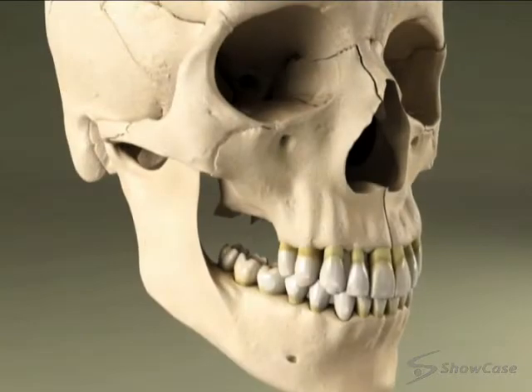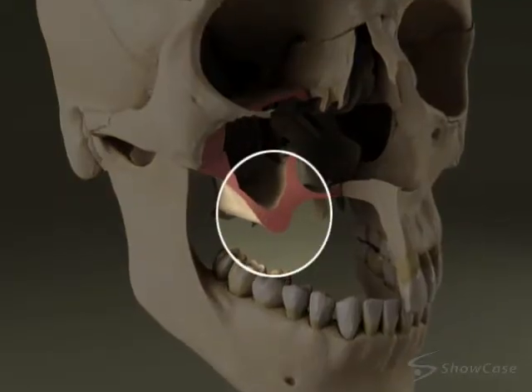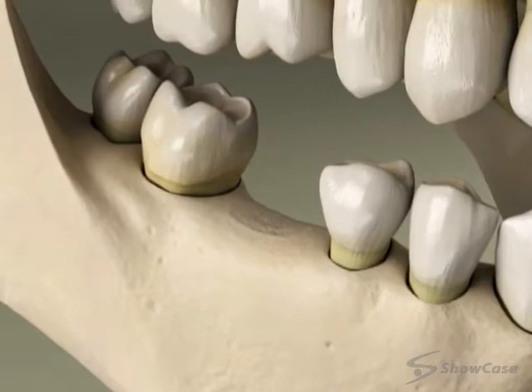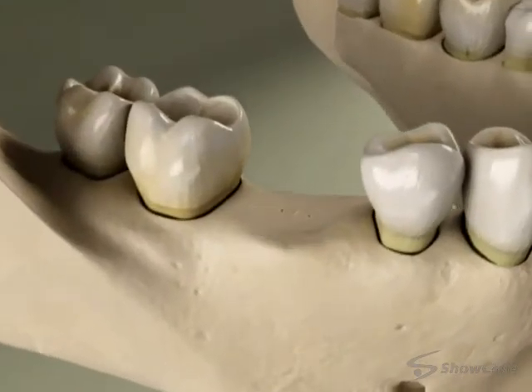A sinus graft thickens the walls of bone that forms the upper jawbone and the floor of the sinus. Bone grafting replaces the height and width of the jaw where bone tissues have receded, and ridge preservation fills the empty socket of an extracted tooth.